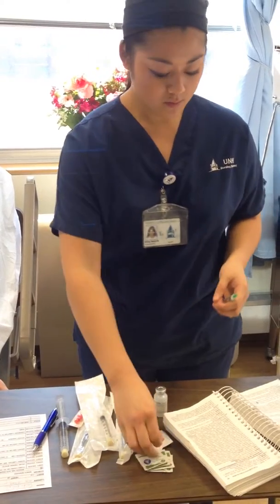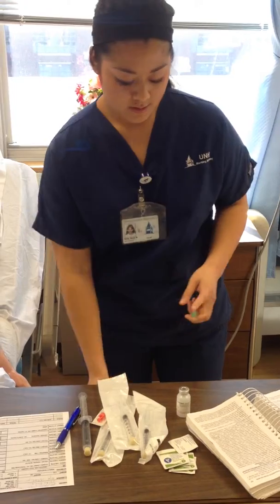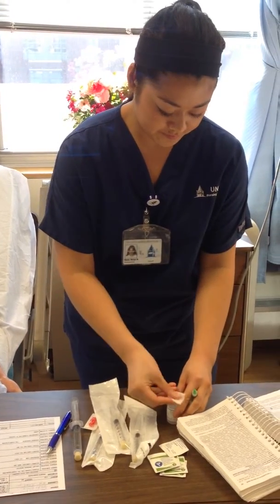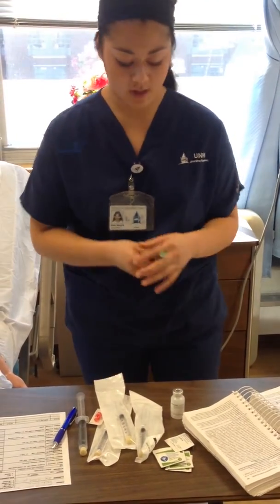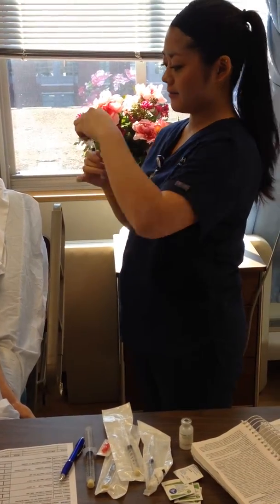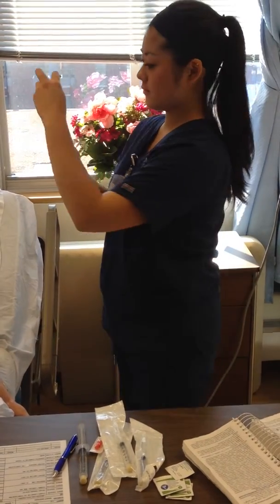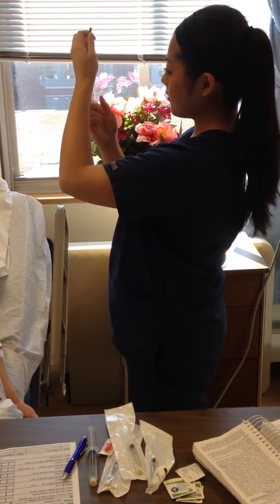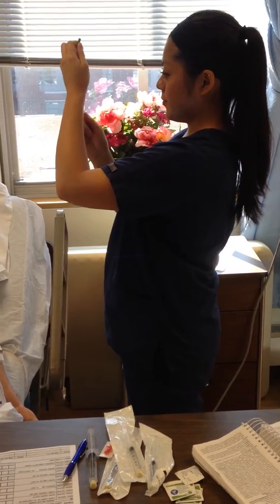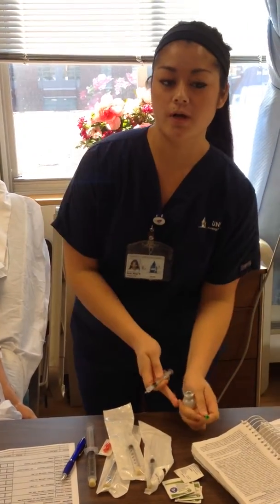So again, we're going to draw back 0.5 milliliters of air. Draw up 0.5.